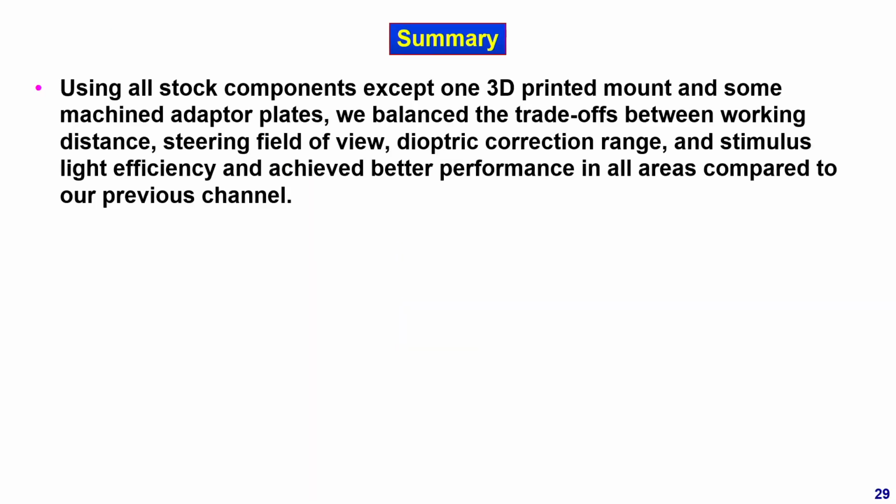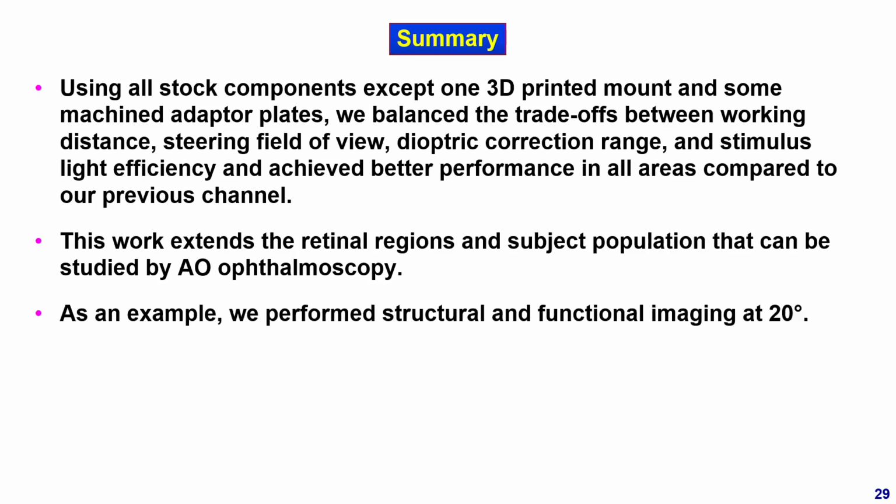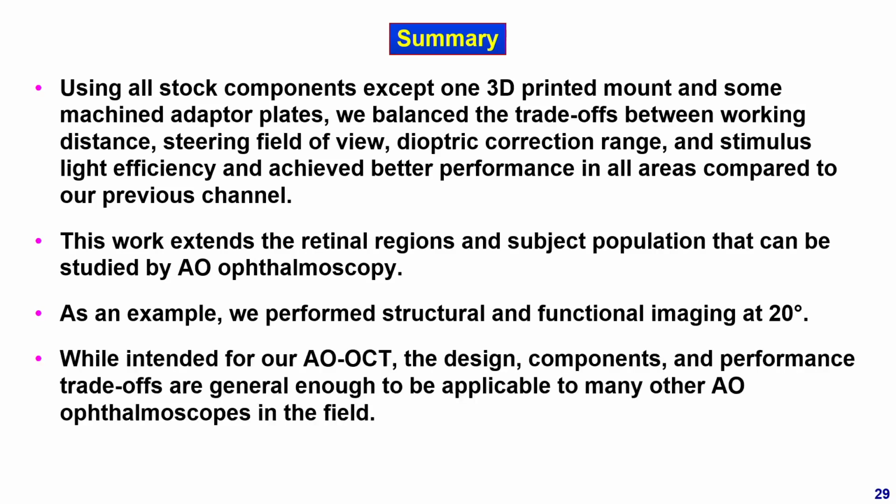In summary, using all stock components except one 3D printed mount and some machine adapter plates, we balanced the trade-off between working distance, steering field of view, dioptric correction range, and stimulus light efficiency, and achieved better performance in all areas compared to our previous channel. This work extends the retinal regions and subject population that can be studied by AO ophthalmoscopy. As an example, we performed structural and functional imaging at 20 degrees. While intended for our AOCT, the design, components, and performance trade-offs are general enough to be applicable to many other AO ophthalmoscopes in the field.